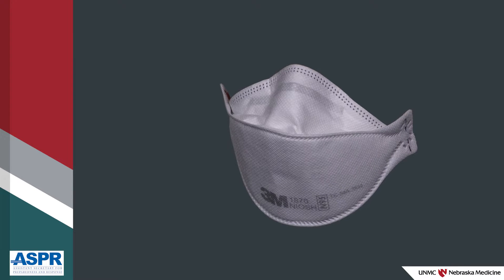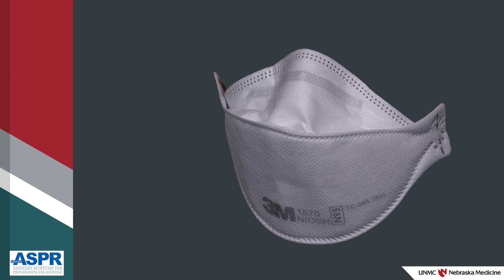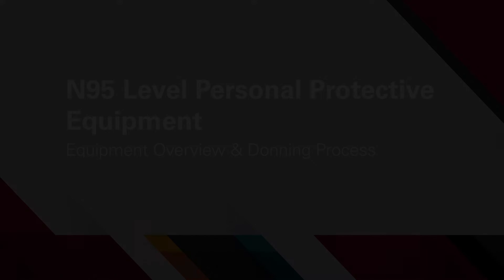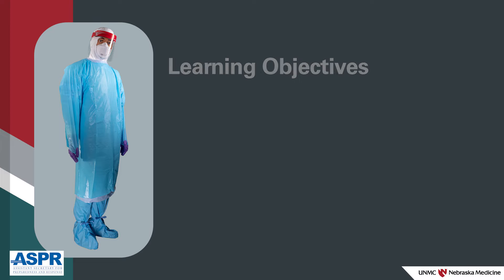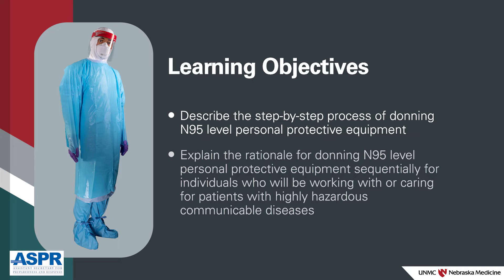In this video, we'll review N95-level PPE that can be worn while caring for a patient with a highly hazardous communicable disease, or HHCD. By the end of this video, participants will be able to describe the step-by-step process of donning N95-level personal protective equipment, and explain the rationale for donning it sequentially for individuals caring for patients with highly hazardous communicable diseases.